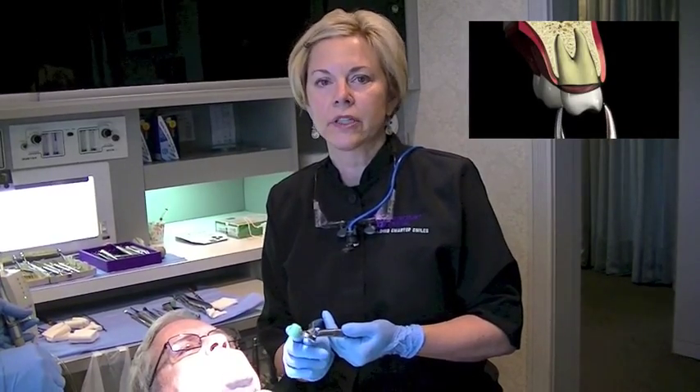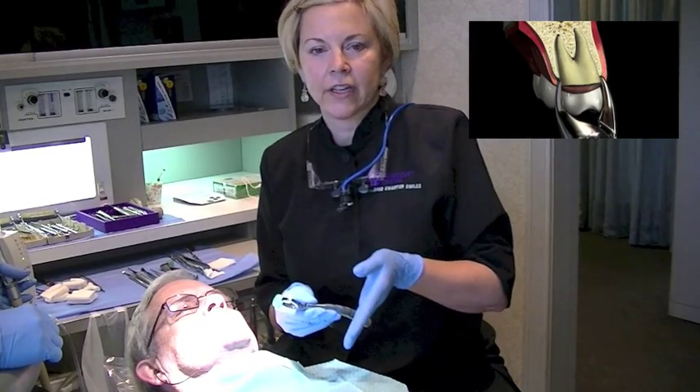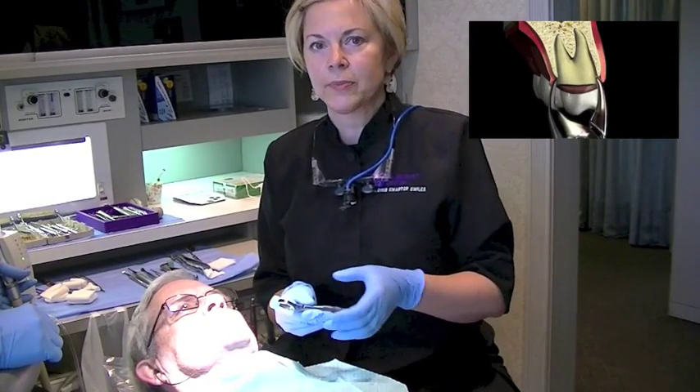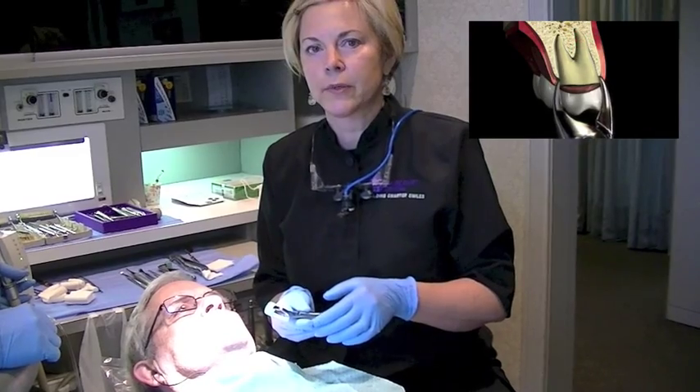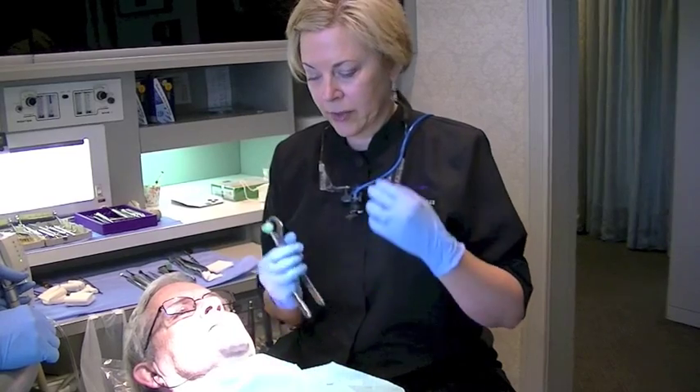Unlike a typical extraction in which the tooth is elevated and rocked back and forth, the physics forceps is used to pop the tooth out of the socket, and it's just a brilliant instrument.